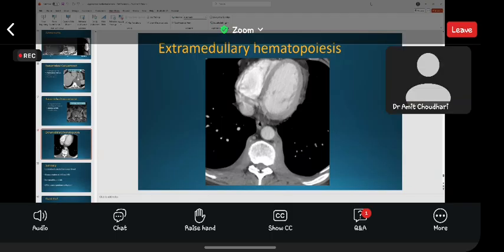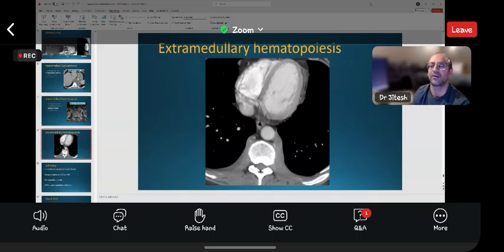Would you recommend a technetium-99 RBC scan? That is one of the scans you can do, but usually we do not do it, and it's a benign condition. Most of these patients also undergo PET-CT for imaging, leukemia and lymphoma patients. So if there is no FDG uptake, we're not expecting to see FDG uptake similar to the leukemic or lymphoma infiltration elsewhere in the body. If you're seeing low-level FDG uptake, this is most likely hematopoiesis. We often do not recommend a technetium scan, but this is something which can be performed. Yes.